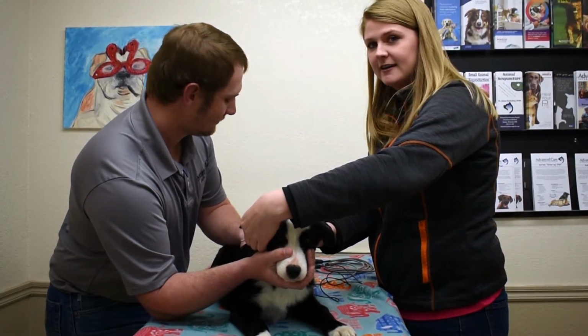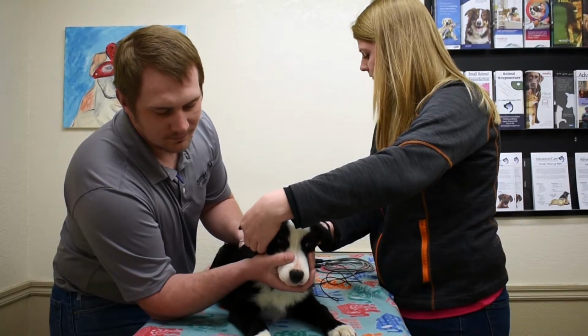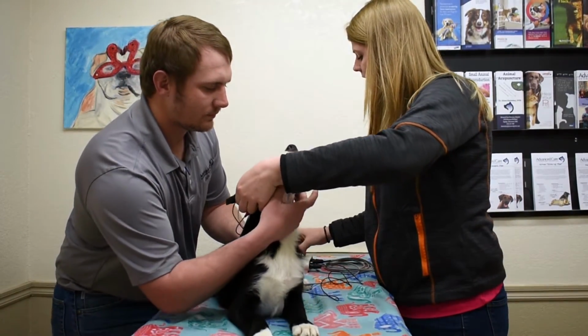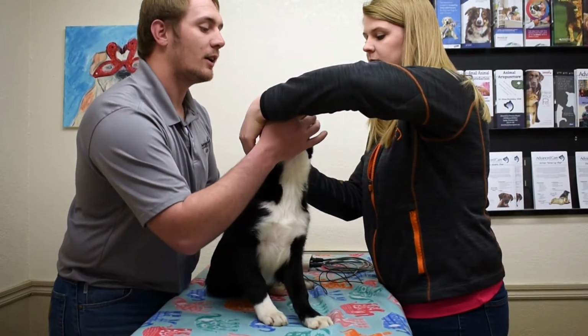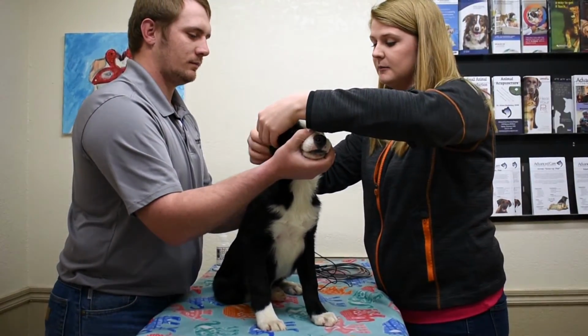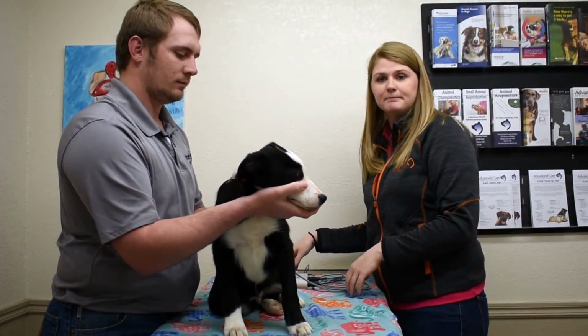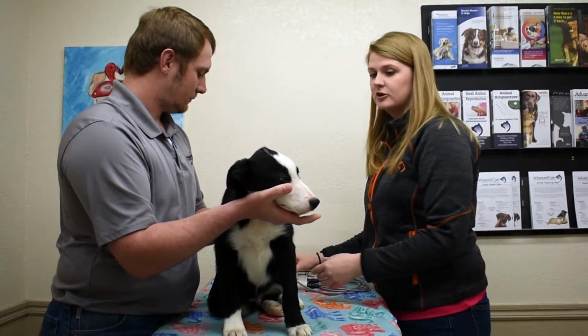So he can hear on both sides. Both sides have shown nice waveforms and nice stimulus. And so I would say he can hear 100%. So he would be a good candidate for a breeding program if he turns out to be a good dog otherwise for the criteria that they're interested in. So that's pretty much the whole test.